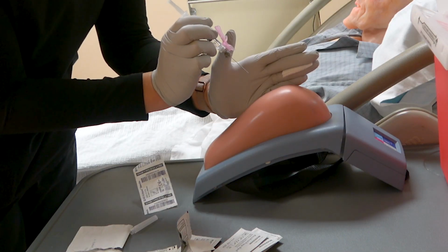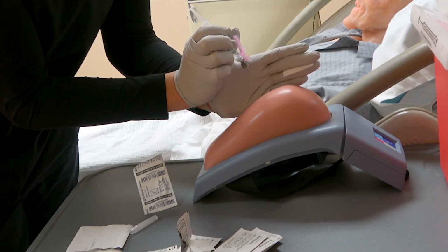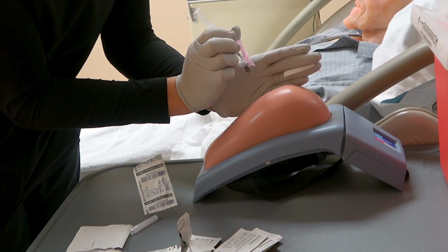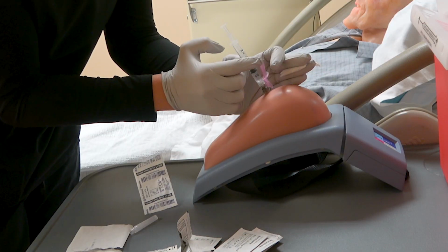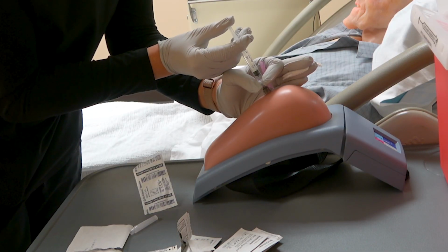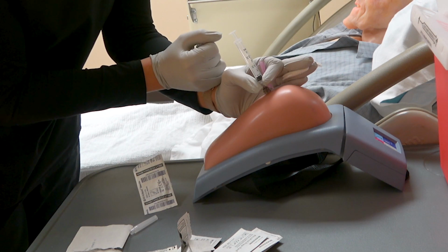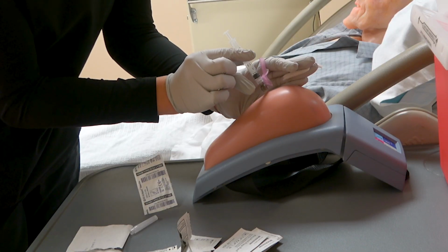Now, when I'm ready to give this medication, I'm going to tell the patient 1, 2, 3, poke, just to give him a little bit of a warning. When you give the injection, you're going to go at a 90-degree angle. You're going to pierce the skin quickly. So 1, 2, 3, poke, Mr. Smith. Then you can use your non-dominant hand to stabilize that syringe. And then we're going to give this medication slowly. Once we've given all of that medication, we're going to let it sit there for 10 seconds before we withdraw the needle. Then we're going to withdraw the needle.